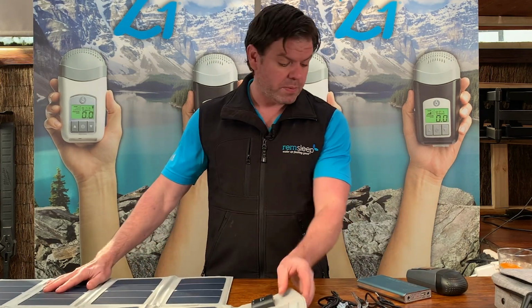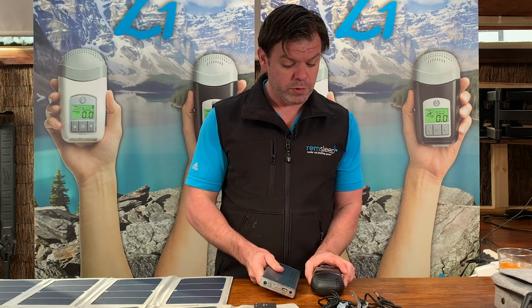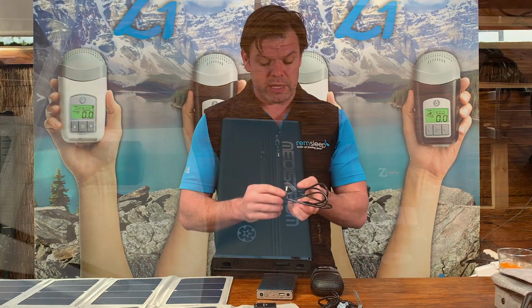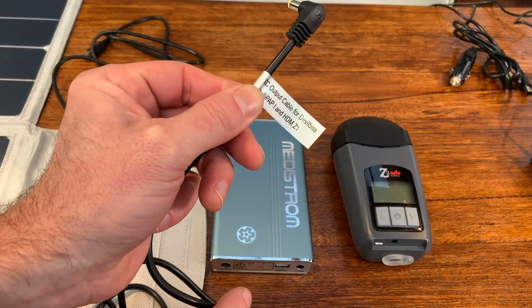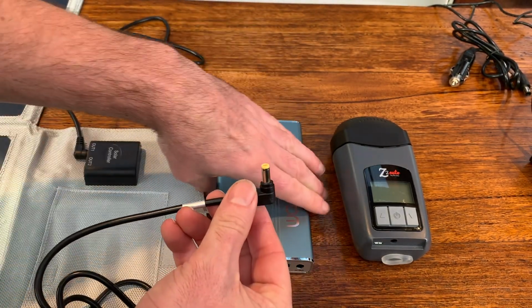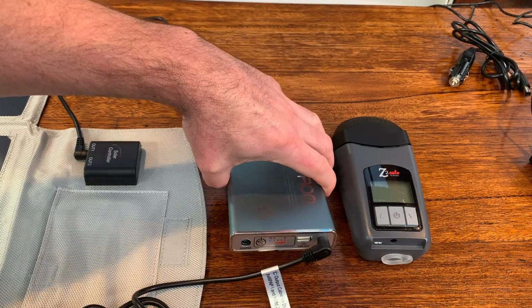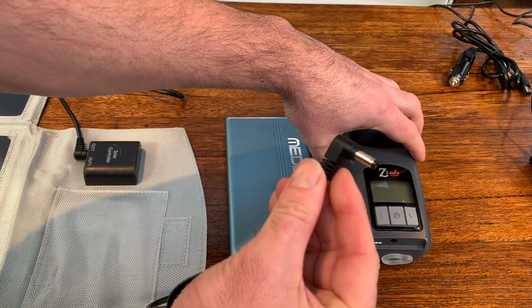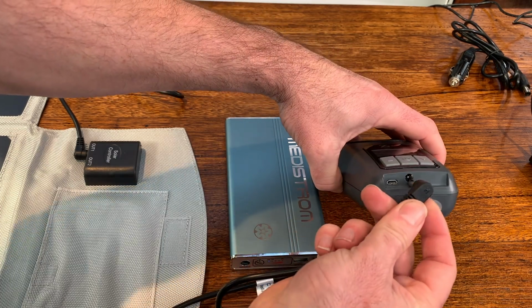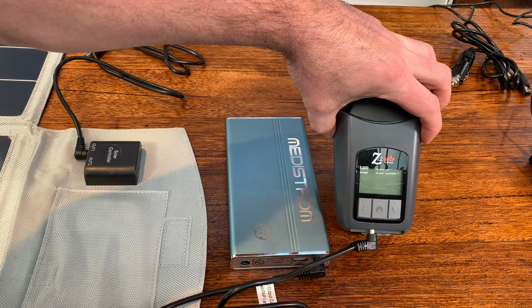And the first thing I'm gonna talk about is connecting up the battery to the Z2. It's pretty straightforward. There's a little cable here, which is called the DC output cable. And all we do is just grab the one end that has the little yellow part on the end of it, put it into the DC output of the battery. So that's the power running out of the battery. And the other part just goes into the Z2. And once you plug that in, that's now got power to it and it's ready to go.